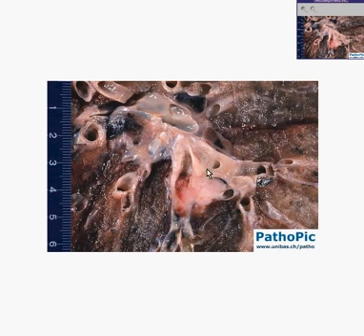I could see a very clearly well-defined anthracotic lymph node here. And I would suspect that this would be negative if you put it under the microscope, but if there were some microscopic nests, I would modify my hypothesis.